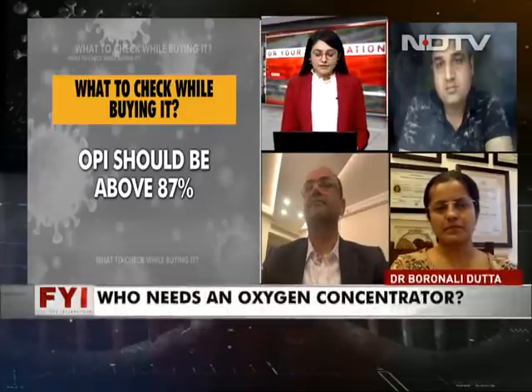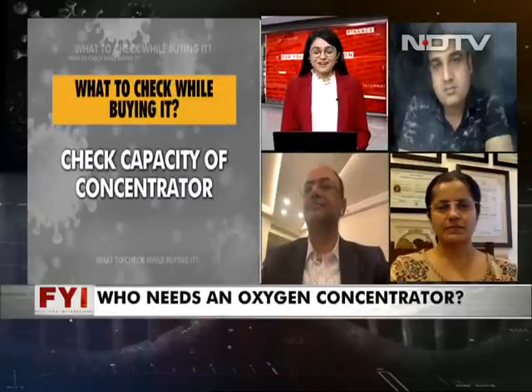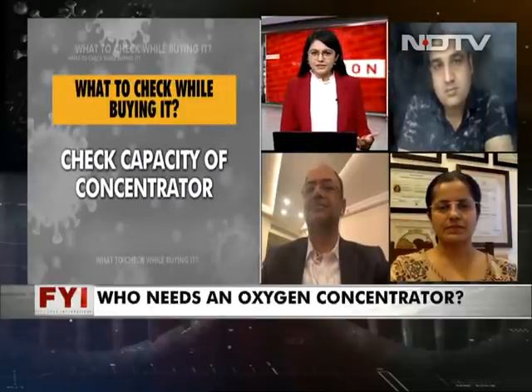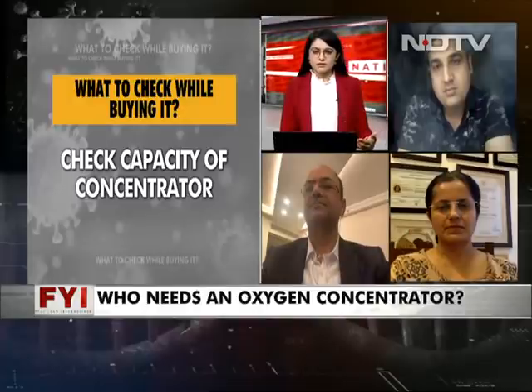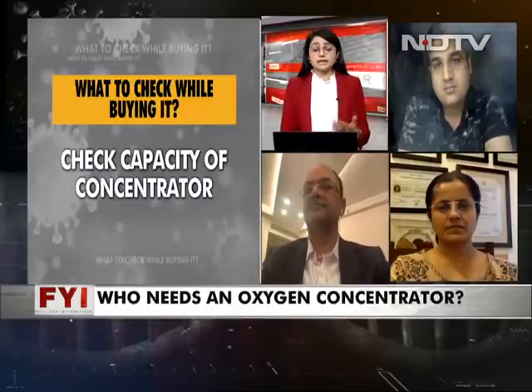Right. Talking about limitations, and before I go to those actually producing it, lots of questions on that front as well. Are there any side effects maybe to using an oxygen concentrator for longer duration, something that people should keep in mind? Certainly, keep yourself hydrated is one thing that is advised.